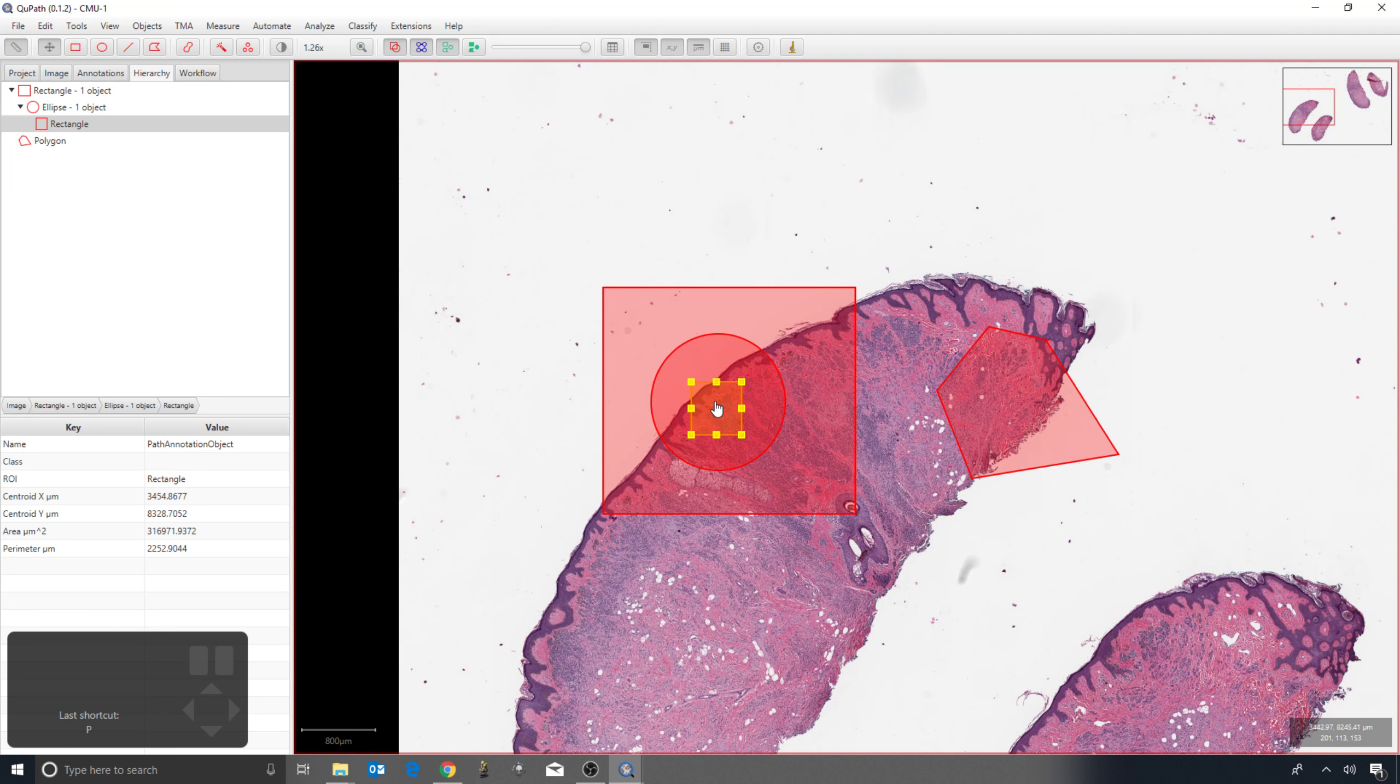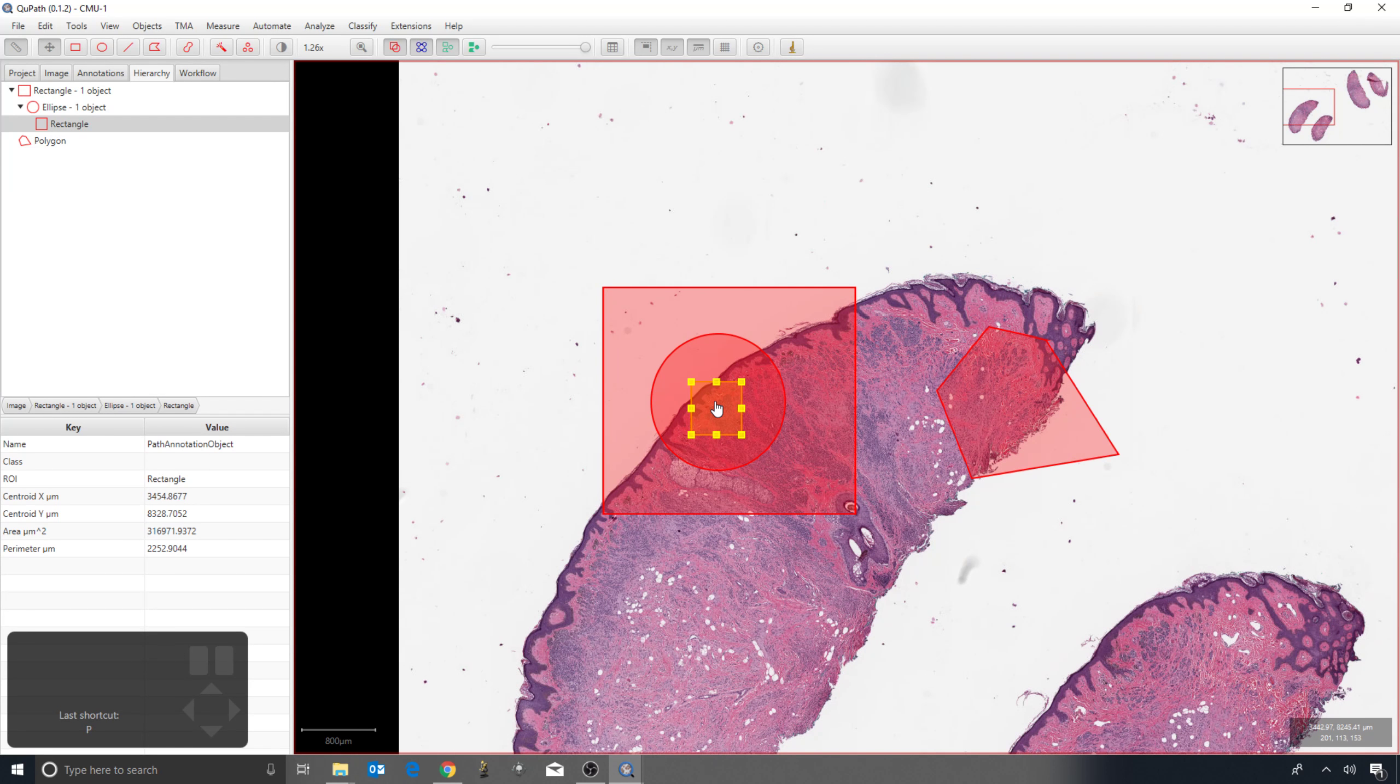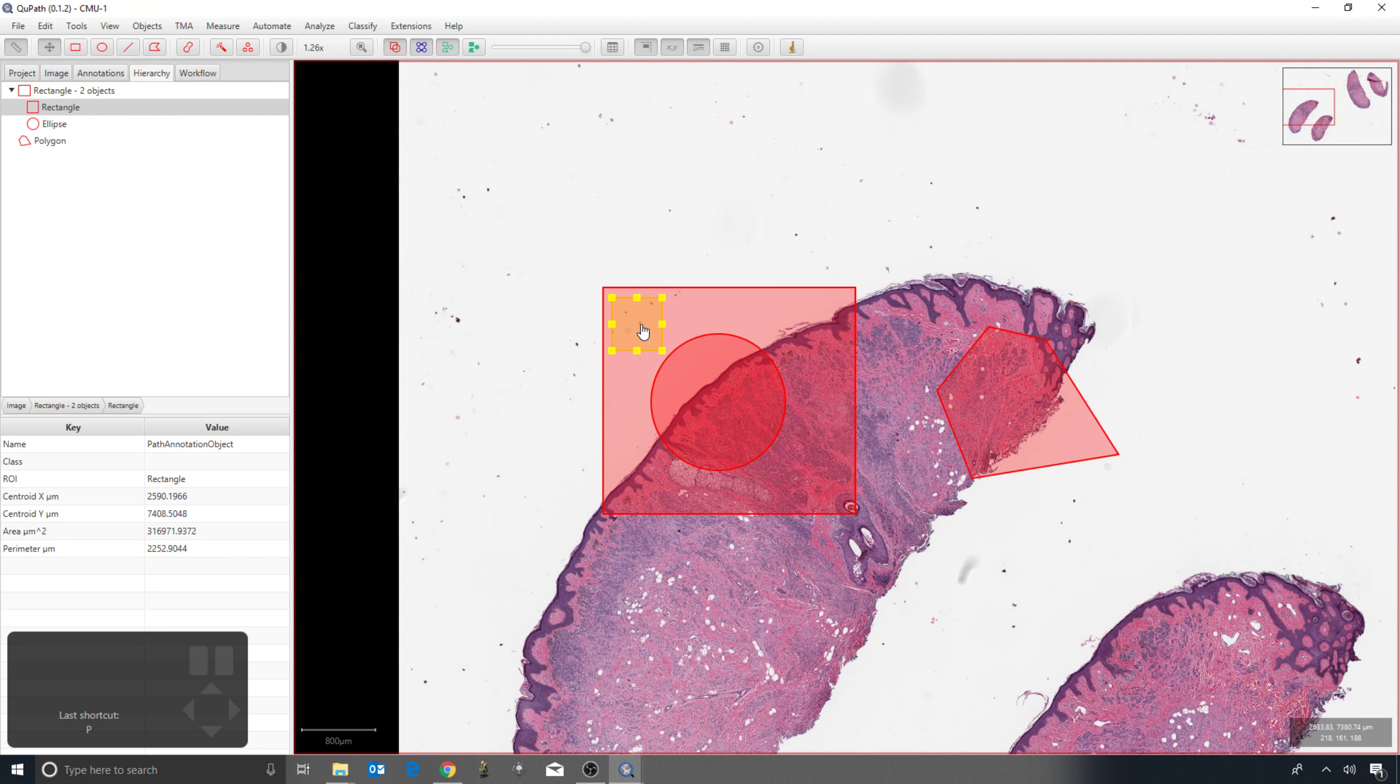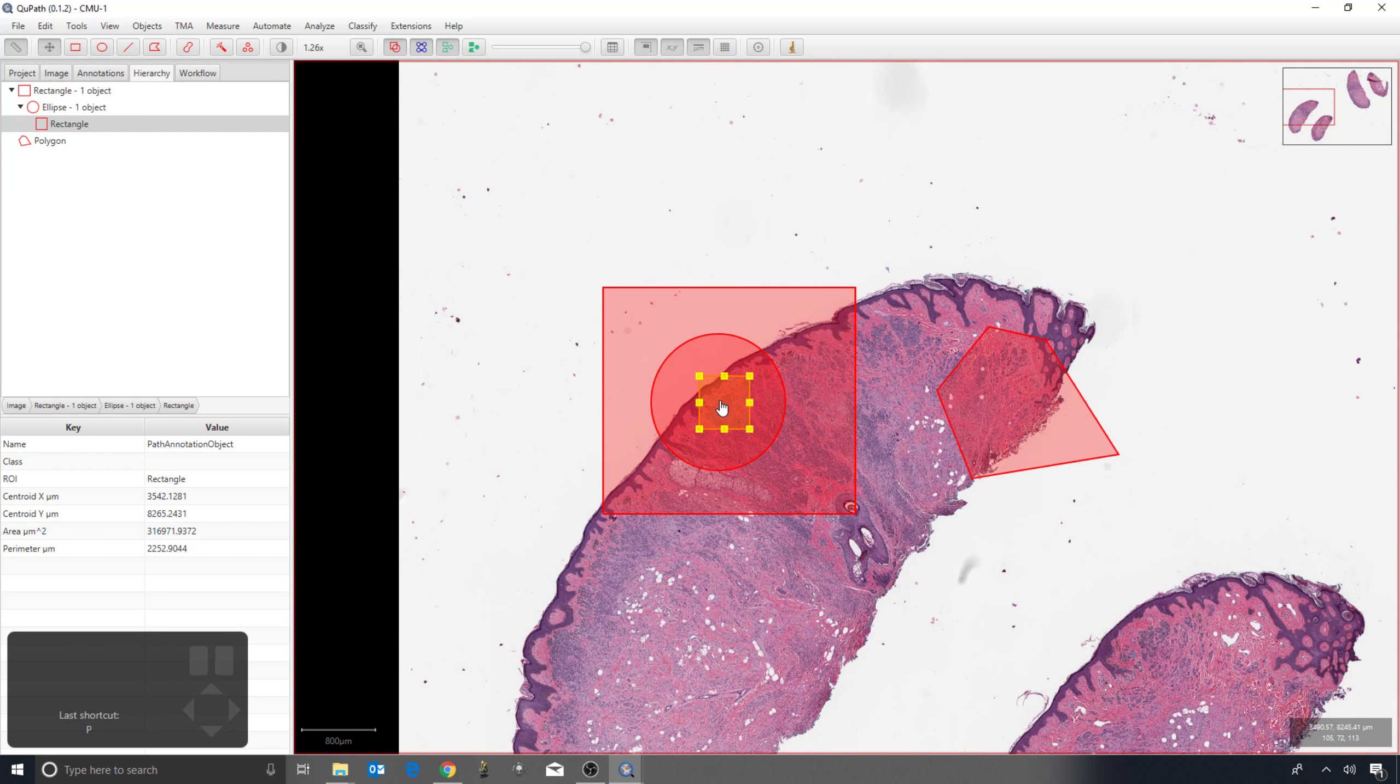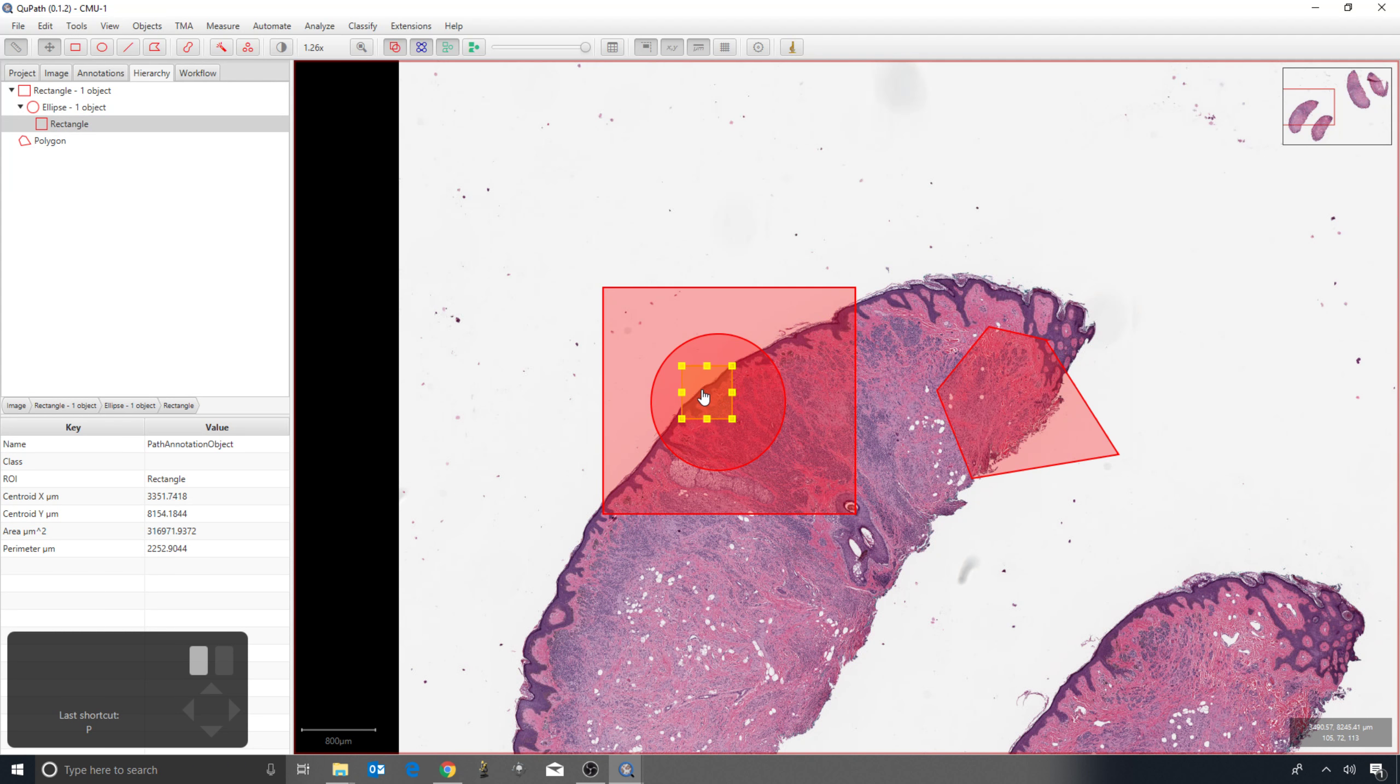If I move an object, QPAP will try and update the hierarchy as it does that. This is intuitive most of the time, but there is a limitation where it can surprise you if you have overlapping annotations.